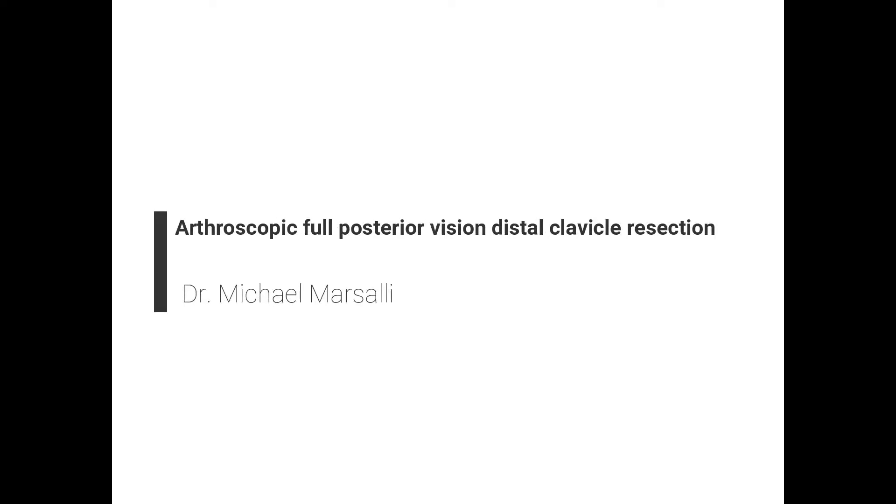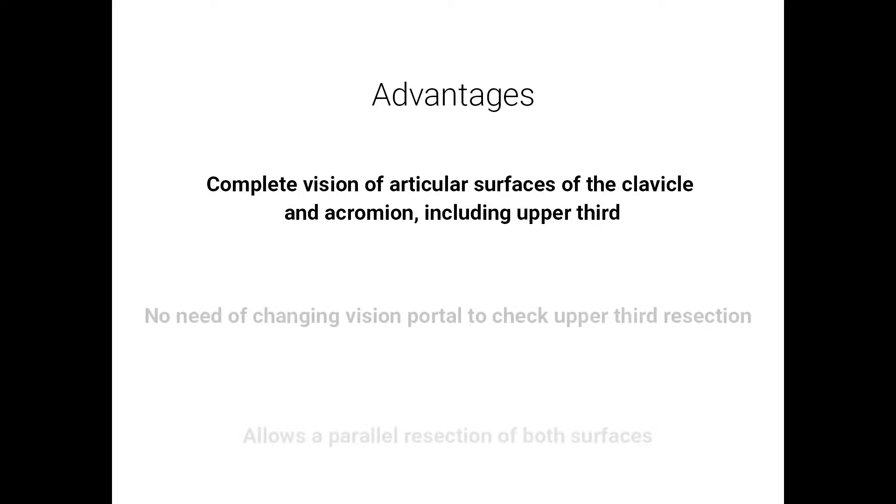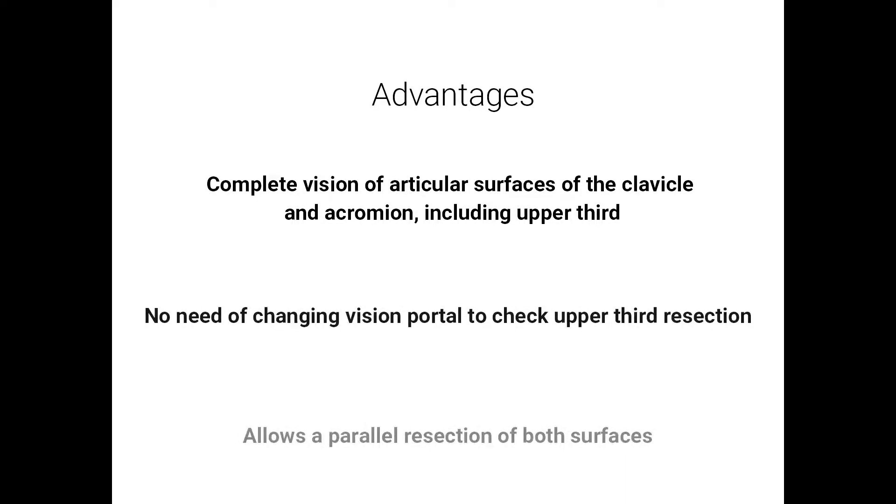Arthroscopic full posterior vision distal clavicle resection. This technique provides complete vision of the articular surfaces of the clavicle and acromion, including the upper third. There is no need to change the vision portal to check upper third resection, and it allows parallel resection of both surfaces.